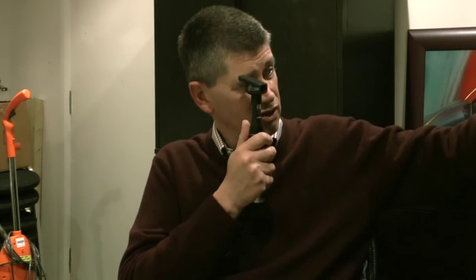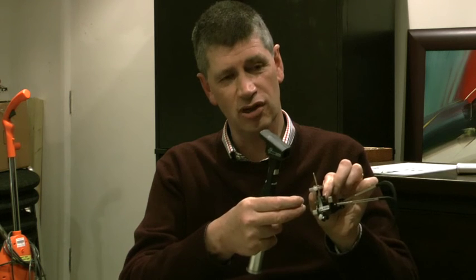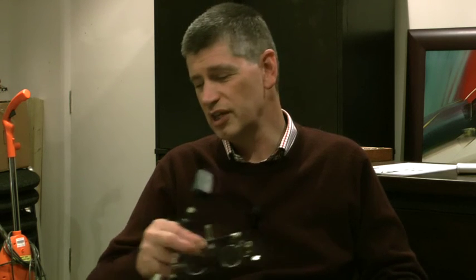An important consideration in retinoscopy is the working distance lens. Since you're working at a particular distance - about two-thirds of a meter or arm's length - you must use a plus 1.50 working distance lens. The easiest approach is to start with plus 1.50 lenses in the trial frame, perform retinoscopy, then remove the plus 1.50 lenses at the end to get your result. Subjective refraction should follow to verify the retinoscopy finding.